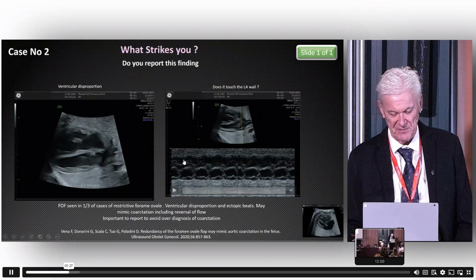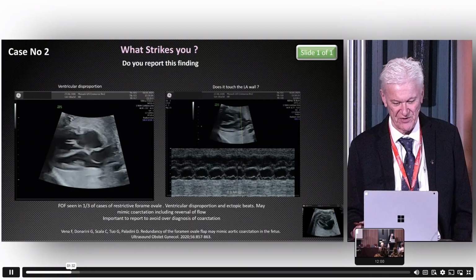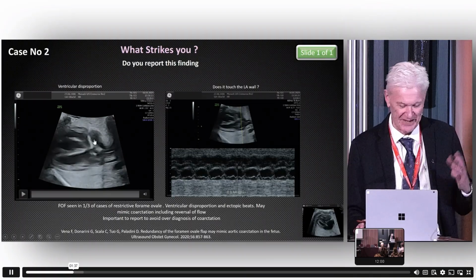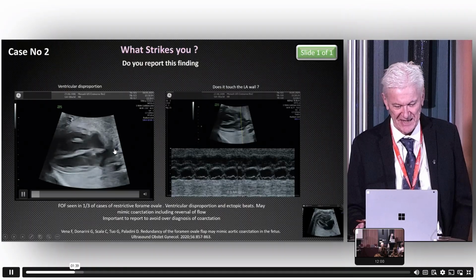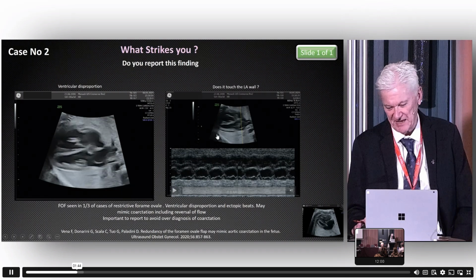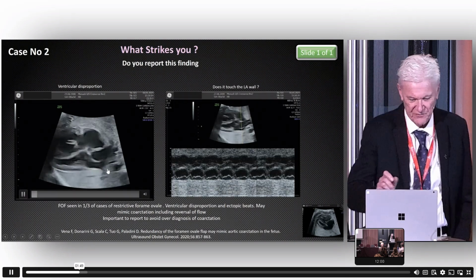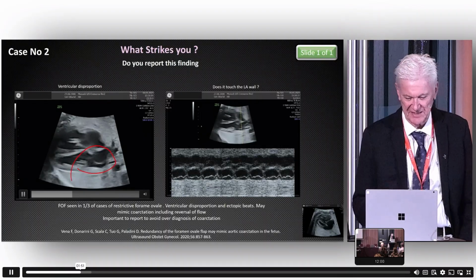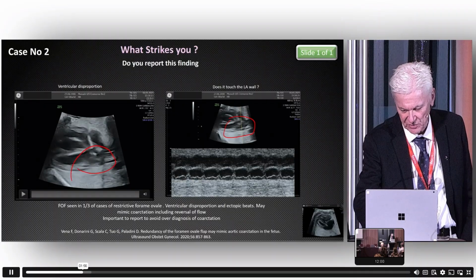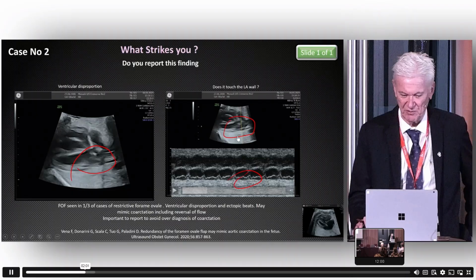This is a question which I would like to put forward, maybe to Juleni, and maybe Bev, I'd do the next one. This is a routine scan that you do in a baby in, say, a third trimester scan, and you find the presence of a flapping foramen ovale. What I've done in this scenario is an M-mode to see whether the foramen ovale touches the left atrial wall.